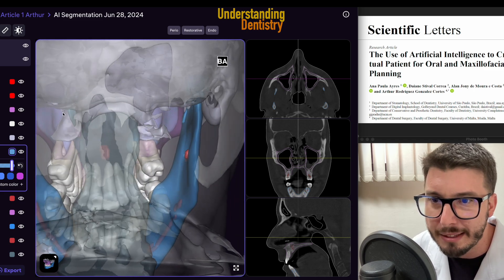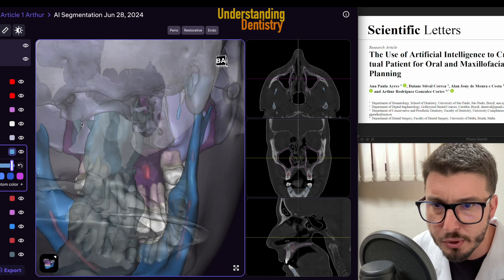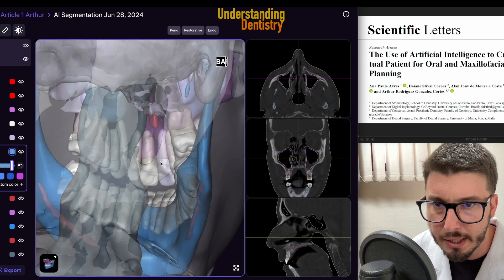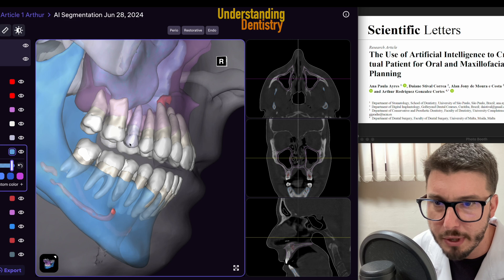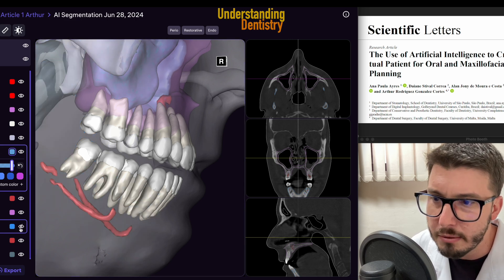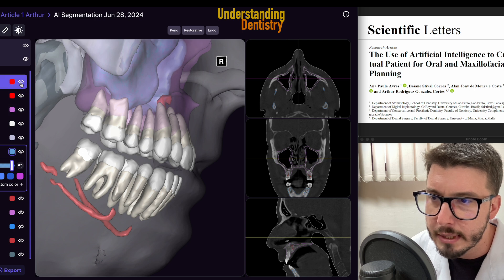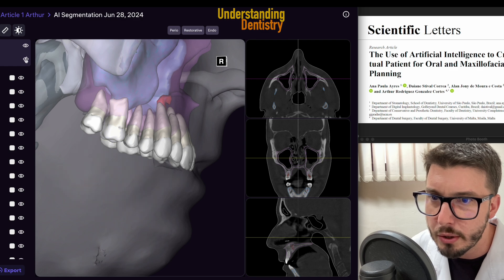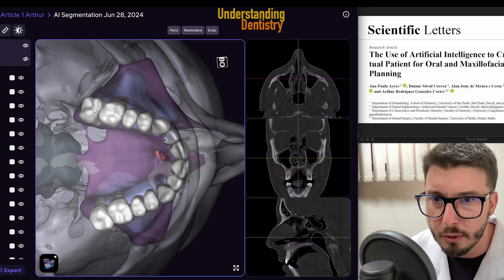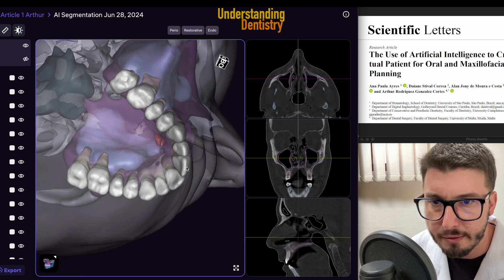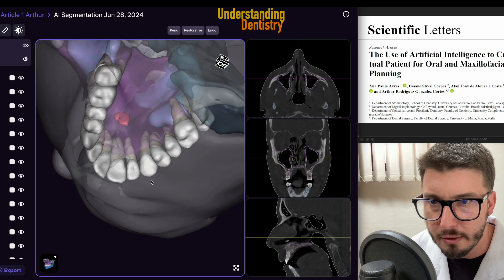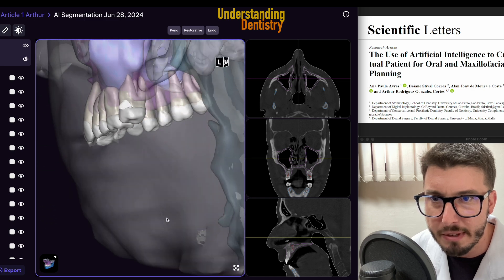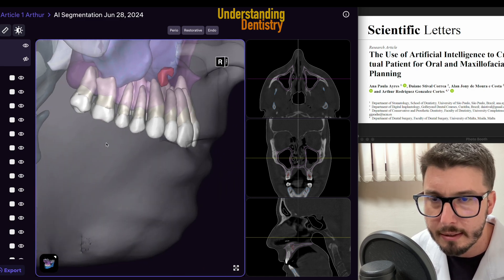We are here contouring from the palatal view for you guys to see the nasopalatine canal. Now if I remove the mandible and all the lower teeth — the lower jaw — then the nasopalatine or incisive foramen and the canal become visible. The canal is there. Sometimes it can be visible in different ways.